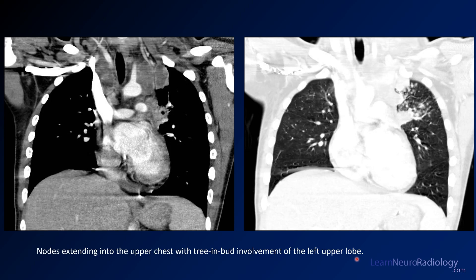A couple of images through the lungs show the necrotic appearing nodes extending to the upper chest. A nice clue here is the tree-in-bud abnormalities in the upper lungs, which is pretty typical for a mycobacterial infection.